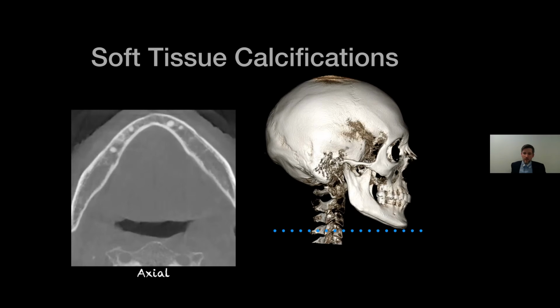So the classic example would be a mandibular implant that ended up going in the IAN. The question would be, well, did you base that off of panoramic, or did you base it off of cone beam data, a 3D scan? So I think that is more around where litigation is going. I think it's more, did you use 3D as opposed to 2D?